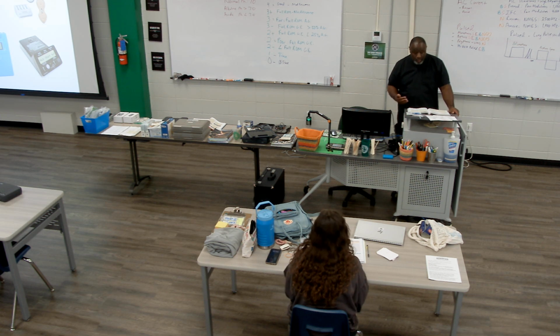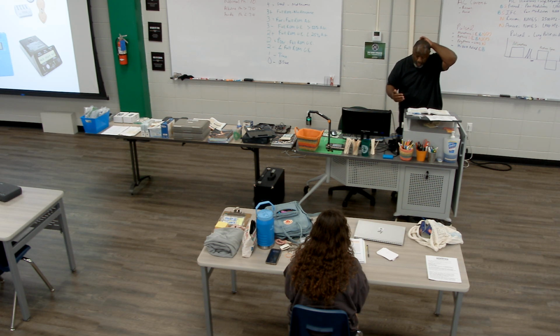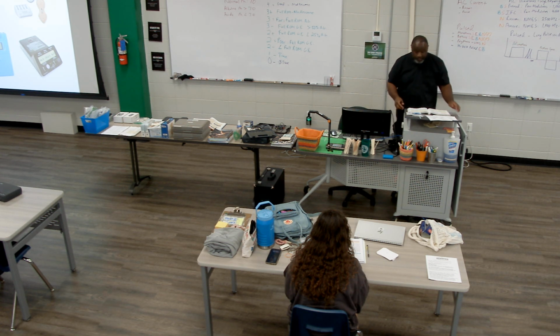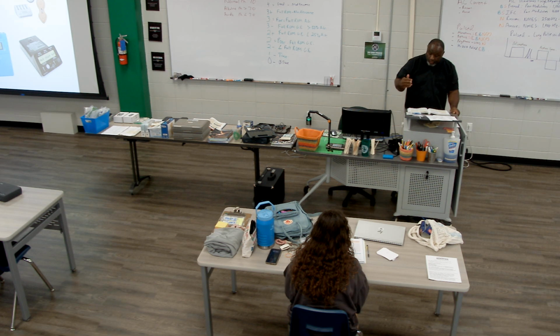The second electrode is only present to complete the electrical circuit. The patient is also incorporated. The circuit includes the drug delivery electrode, the patient, and then the non-treatment electrode. The waveform for iontophoresis is DC, so it's DC current that's going to go through the patient. Variations of impedance result in current intensities, and voltage regulated Ionto devices demonstrate inter-subject variability. So everybody is not going to handle Ionto the same.